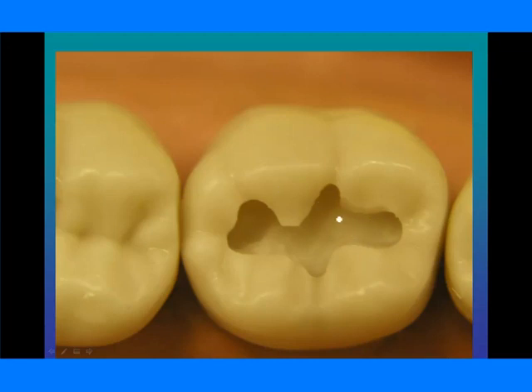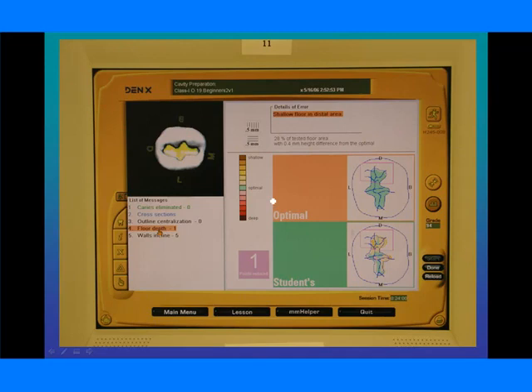Now I'm going to go back. I'm going to click on the evaluation button again. And you'll notice now my outline shape is taken care of. My grade now is a 94. So now that I've corrected all of that, I can go into floor depth and wall incline and try to correct these to get more points back.